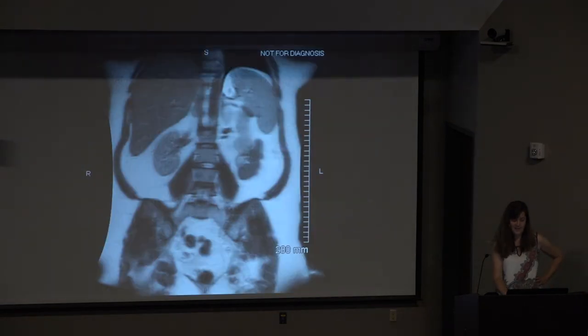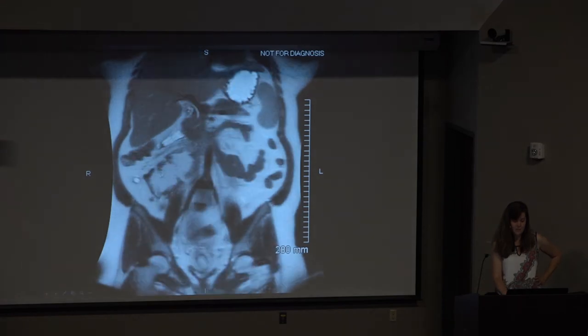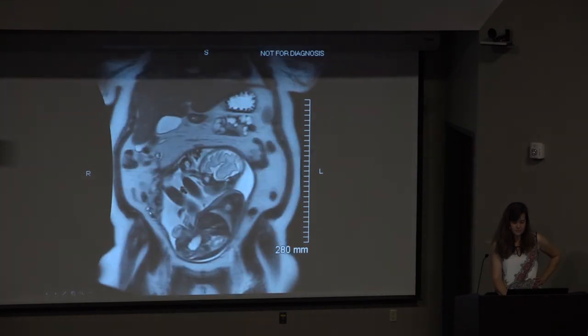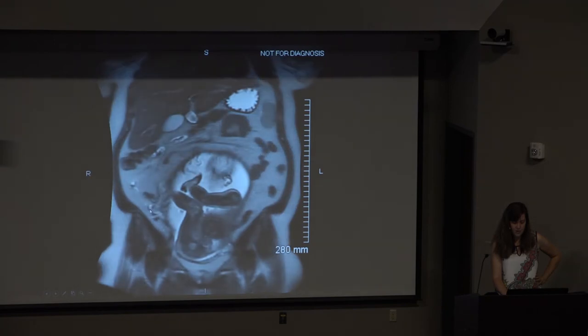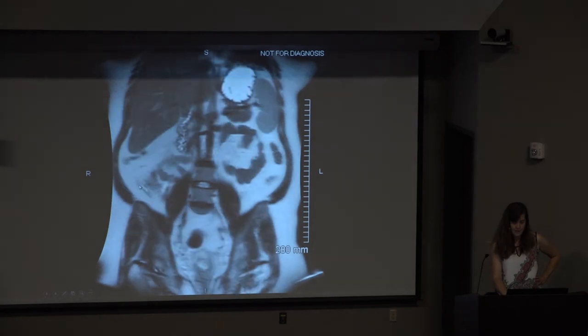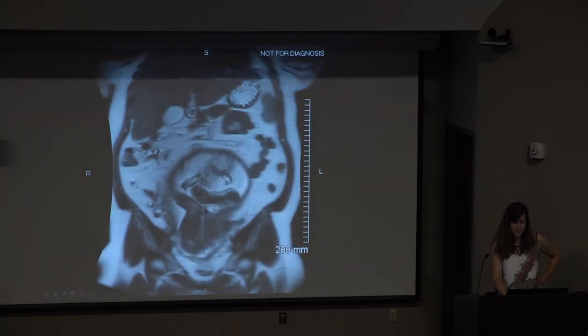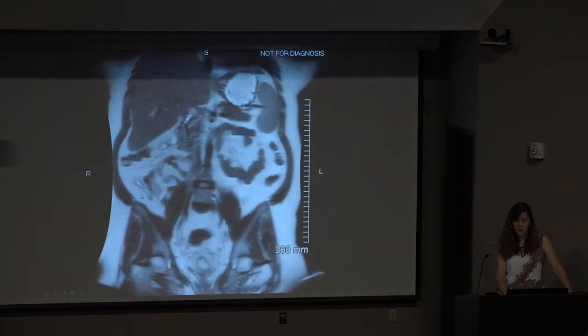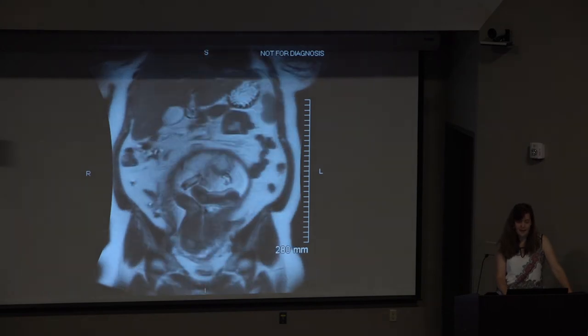Sorry. So the pathology is, we have all these wiggly bowel loops, but all of a sudden there's this kind of tubular structure. I'm just going to run back and forth. Here is a tube, and it's filled with fluid. If I follow it where my arrow is, it connects to the cecum in the right lower quadrant. So it's a blind ending tube filled with fluid, and it's dilated. There's a little bit of edema, which is hard to see because the fat is bright. We can fat sat this, which I don't have for you, but that would be edema. And so this is appendicitis.